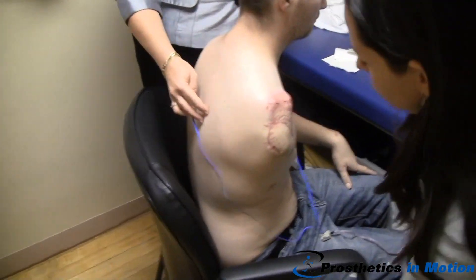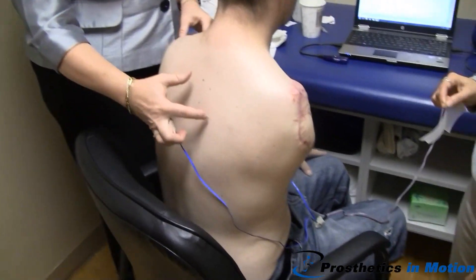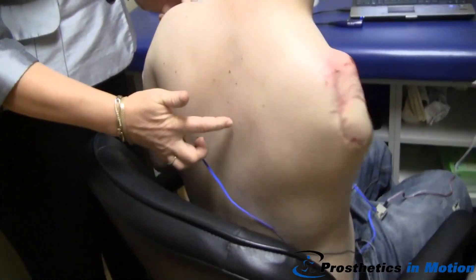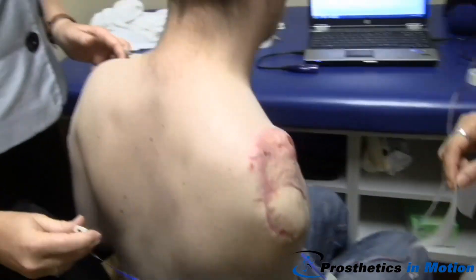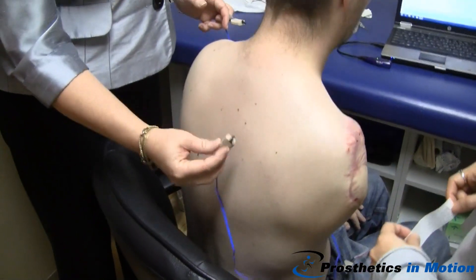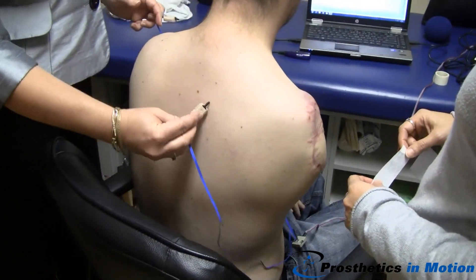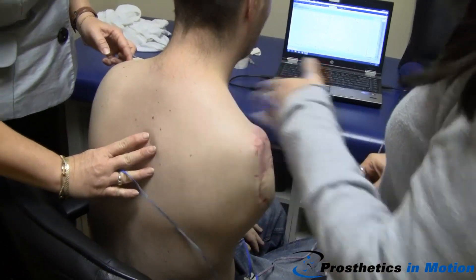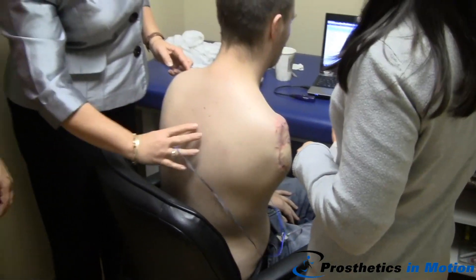Let's start first in the back because we know it's pretty strong. Let's have you bring the muscles together in the back again — that's coming straight back. The long axis is the way these should be placed. Is that the long axis or the wrong way? Probably not. It's coming like this, but if you look at a chart it goes like that, like striations do.